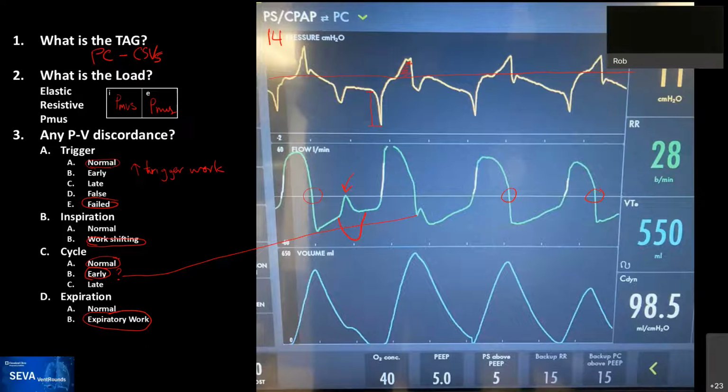In fact, at some point it's zero. And for a millisecond, it's zero. So the ventilator can't generate any PEEP if there's no flow going through the exhalation manifold. Of course, it's more complex than that because it's all dynamic. It's all happening out of phase, and it's crazy, but it's not as simple as a static system that you suck gas out of.